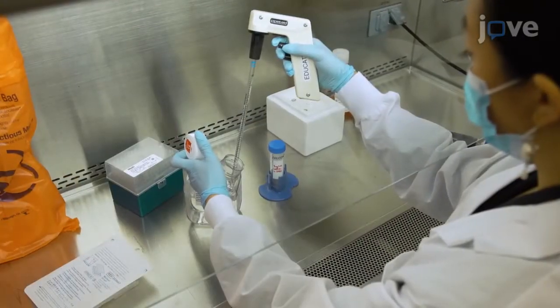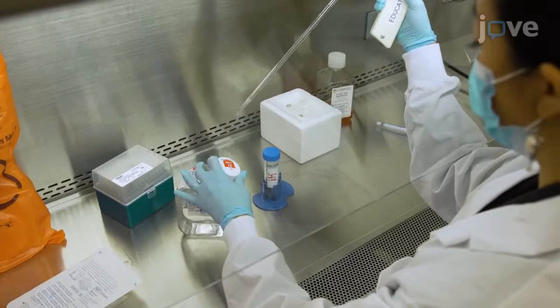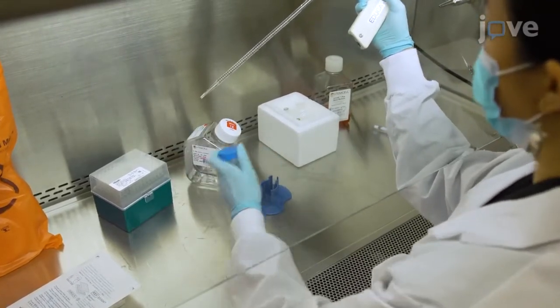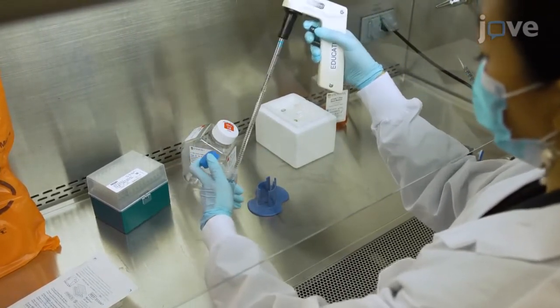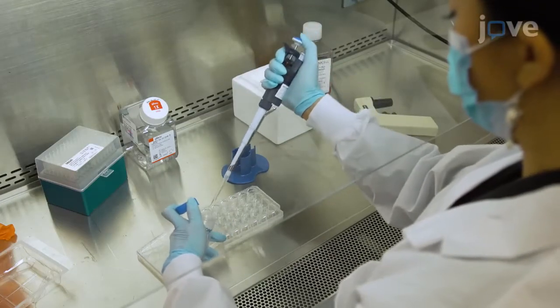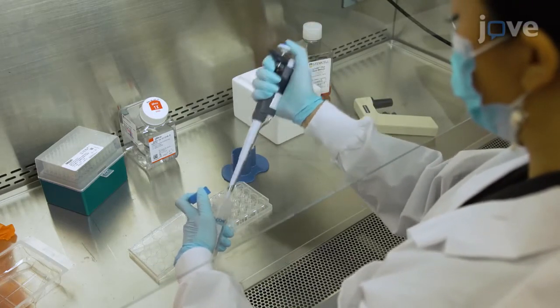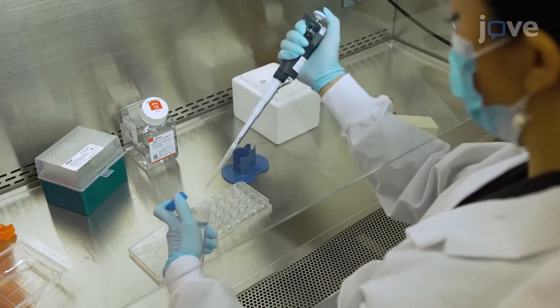To prepare laminin-521 plates, dilute thawed laminin-521 in ice-cold DPBS with calcium and magnesium to a final concentration of 8 micrograms per milliliter. Add 250 microliters of the laminin solution to each well of a 24-well plate, or 50 microliters to each well of a 96-well plate.